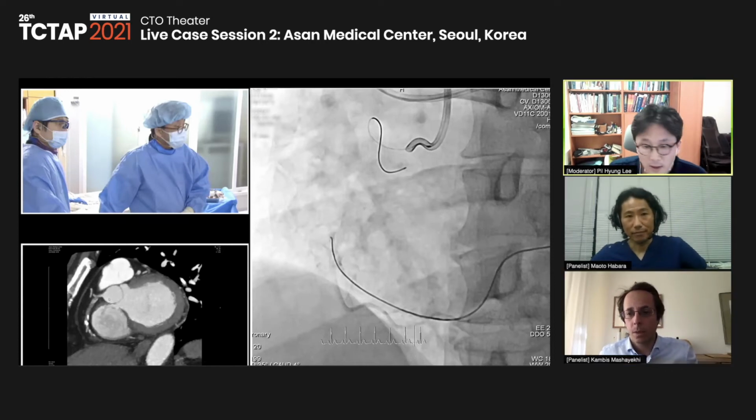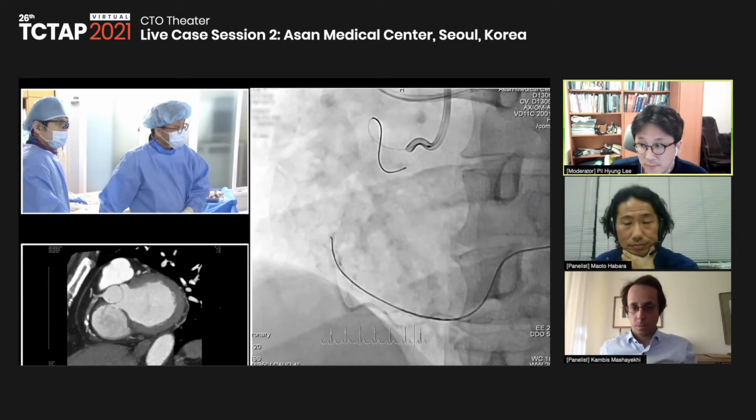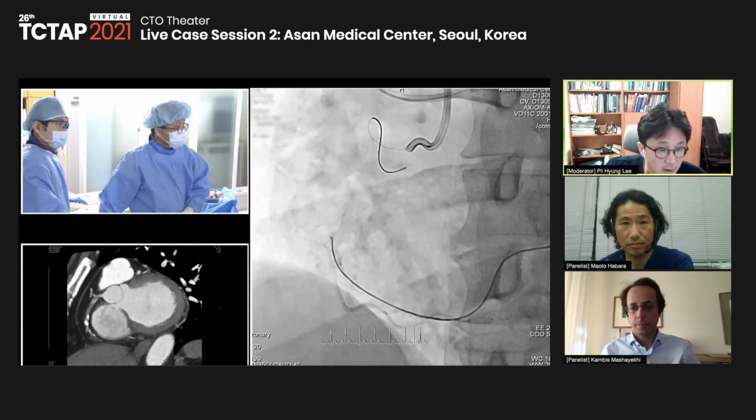Yeah. So I think I have to explain that. This was a previously failed case, and there were some potential septal branches there, but there were two aspects. One was that the previous operators did lots of septal surfing, and they failed. Oh, really? Yeah.